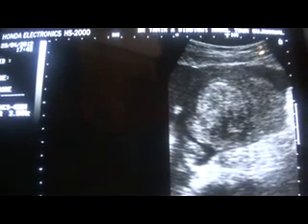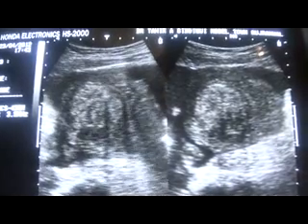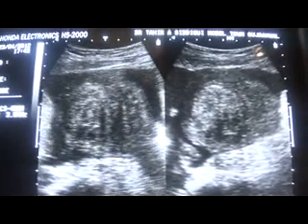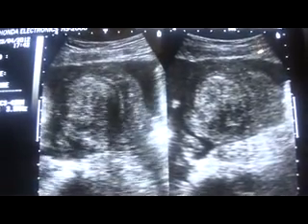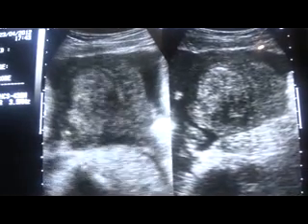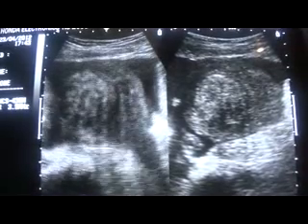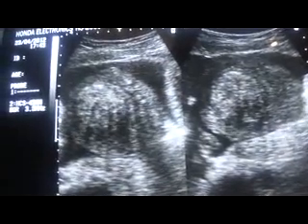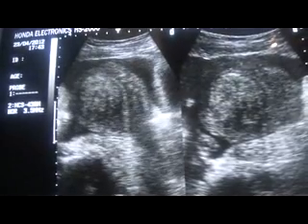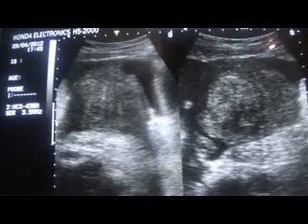One reason for menorrhagia, you can see that the endometrial canal is being elevated. This is the endometrial canal, this line, and the fibroid is elevating it upwards. This is the anterior segment of the uterus, this is the posterior segment of the uterus. So in transverse section, again you will see that this is the endometrial canal, and it is being elevated by the mass.